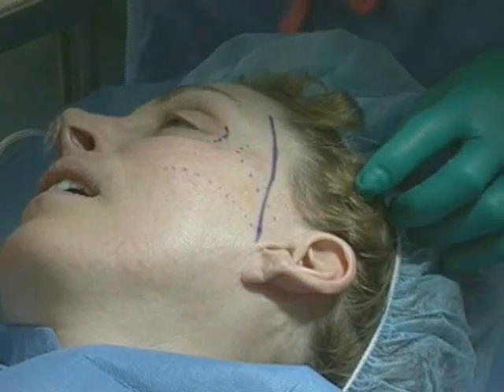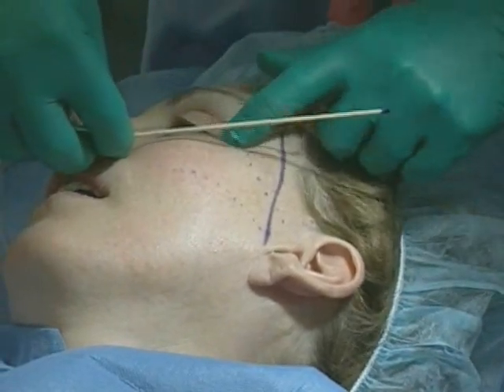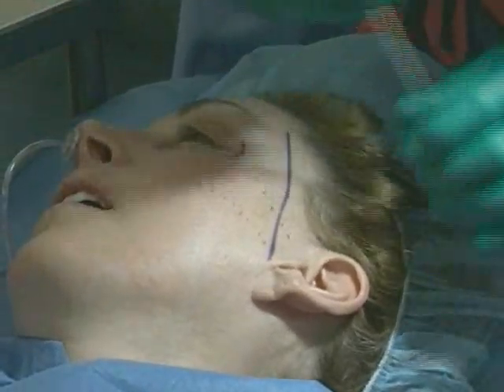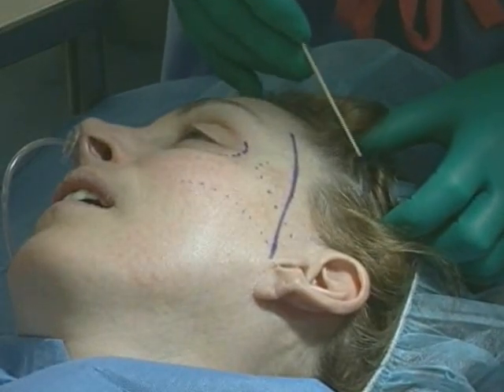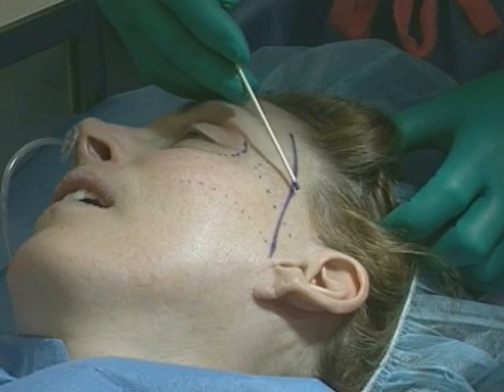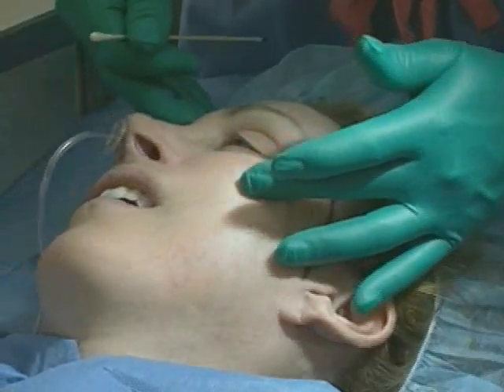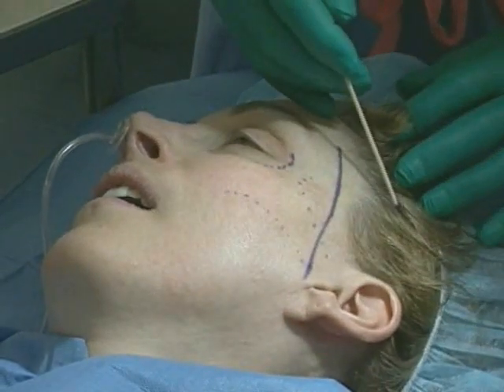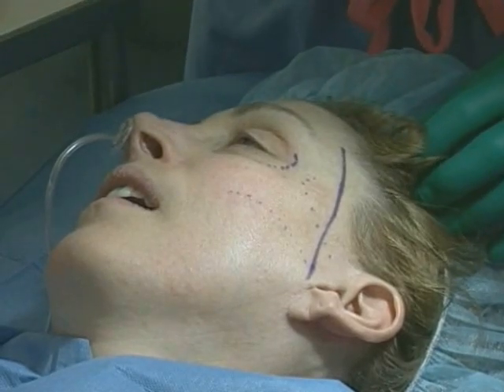I like to course my incision between the ala and the lateral orbital area. I go approximately 2 to 3 centimeters behind the hairline, and I'll make my incision here approximately 2 to 3 centimeters. So I'll dissect down in this area and do it endoscopically, do this intraorally, and then connect those two areas, and then elevate the tissues in this area. We'll close this with just auto staples. We'll close intraorally with 5/0 plain suture.